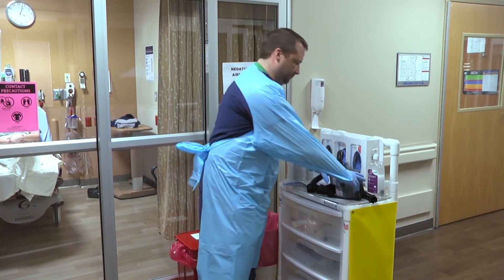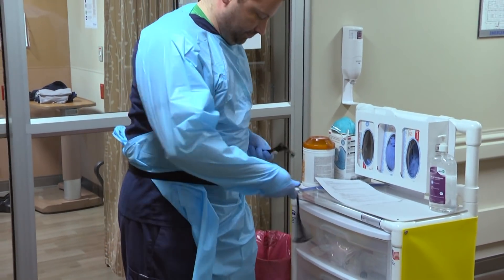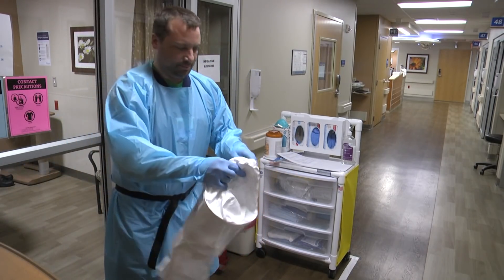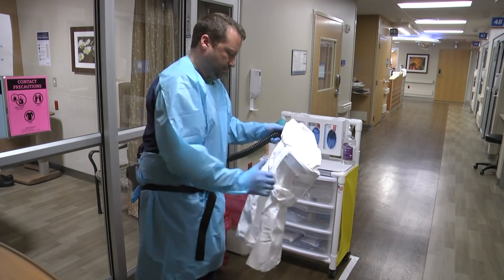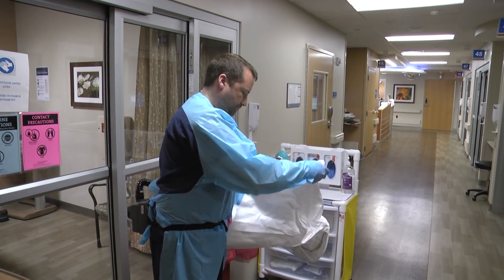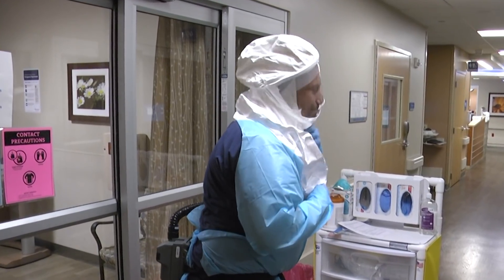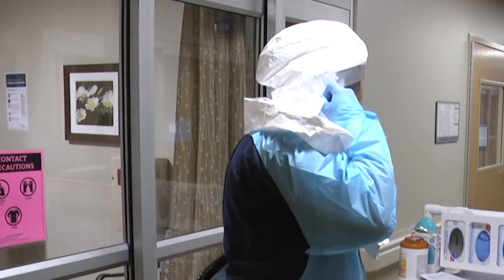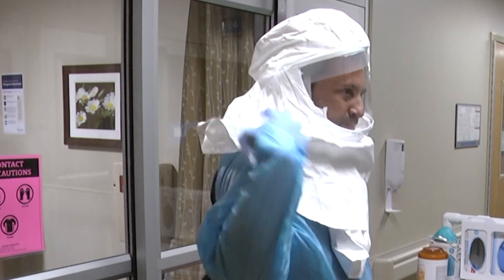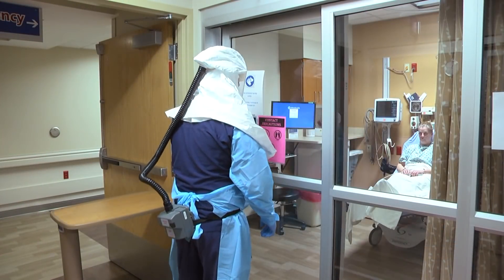Check the battery on the PAPR and attach the PAPR to your waist. Attach the hose to the PAPR hood. Put on the PAPR hood and turn the PAPR on. Ensure all equipment is comfortable before entering the room.